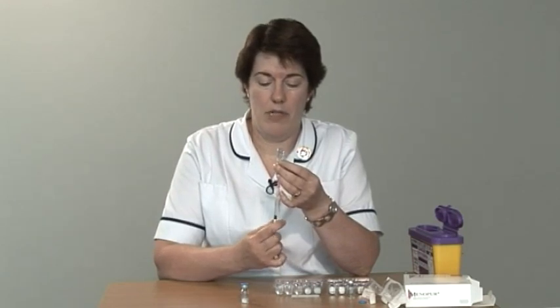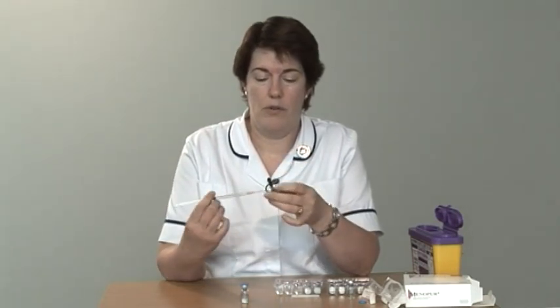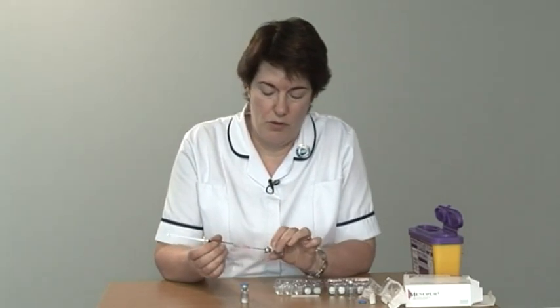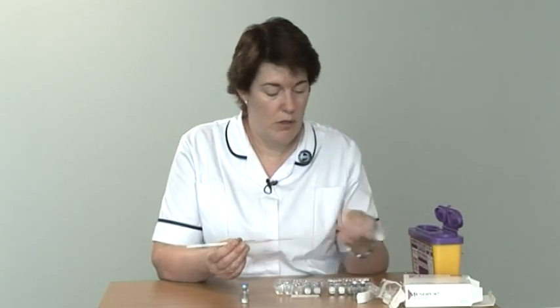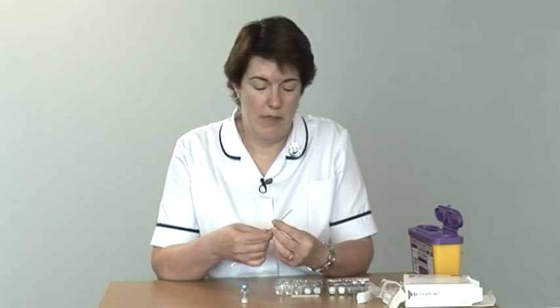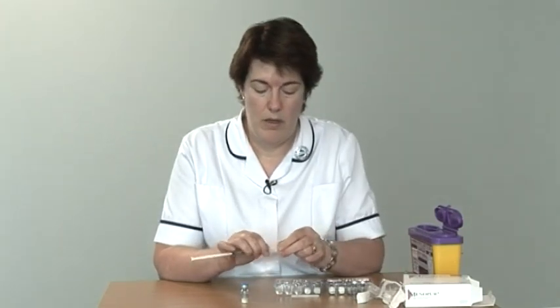And repeat the process if you're going to do 225. So you've then got 3 ampules of powder mixed into 1 ml of the diluent. Change the needle as before to the small yellow one, and now you're ready to administer the drug. Your clinic will have told you how many vials of powder to mix into the diluents and what your daily dose is going to be.